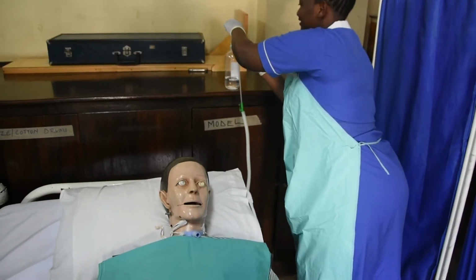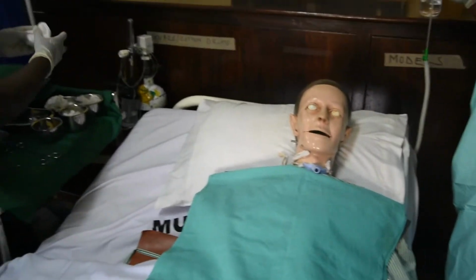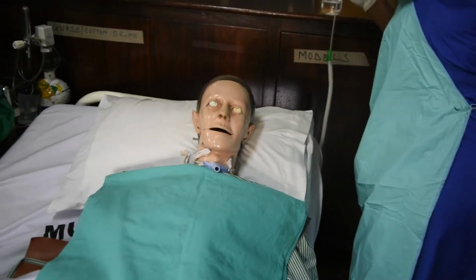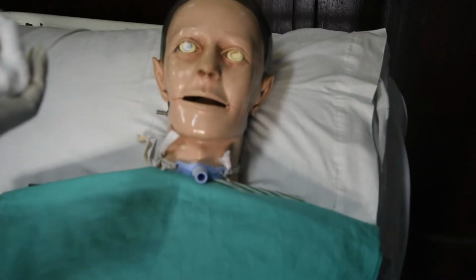So before you go further, you have to make sure the surrounding of the trachea is cleaned. Assistant, help me pull it a little below.